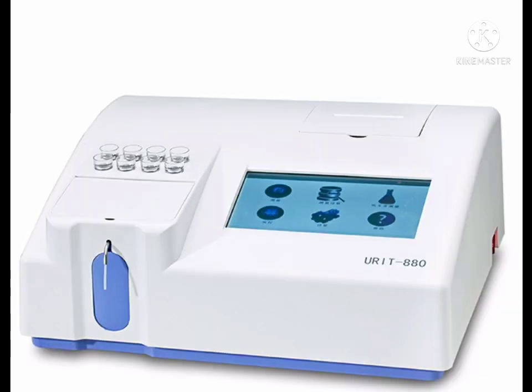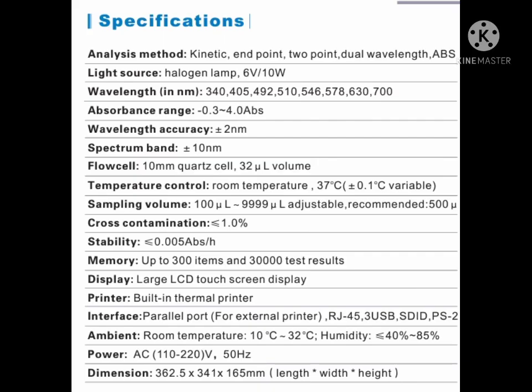URIT 880, it's a semi-automatic clinical chemistry analyzer manufactured by URIT. It's a Chinese company, other Chinese company like MINDRAY. Technical specification of this analyzer. Analysis method is same like other instruments: kinetic, endpoint, 2-point kinetic, dual wavelength absorbance.